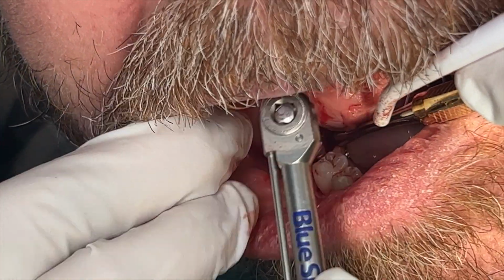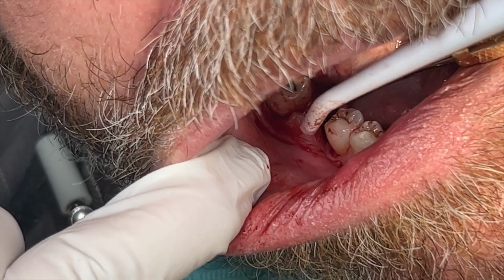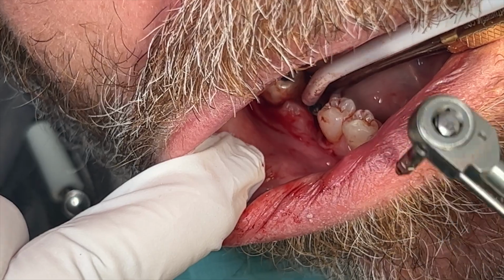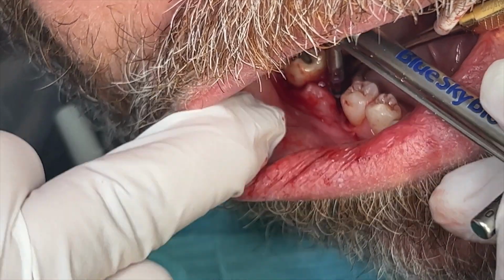And in this case, we can see that the implant is actually 3 millimeters above the bone, and we can actually hand torque it right into the perfect orientation that we want it to. So this was a long journey for this patient. I'm very happy that the outcome turned out very well and the bone integrated smoothly.